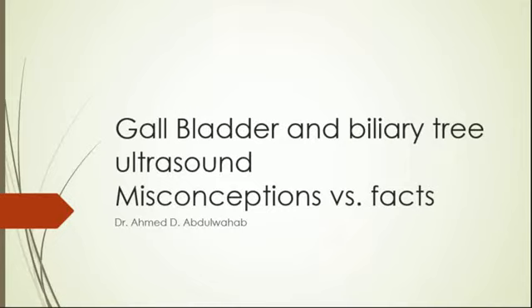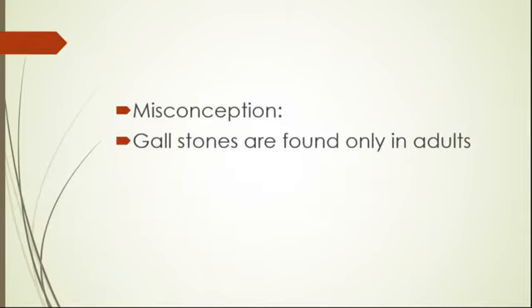Something that we do every day. It's about the gallbladder ultrasound. Every one of us does several gallbladder ultrasounds on a daily basis. The idea behind that is that there are some things that some of us might think are correct information, while in fact they are misconceptions. They are not correct. So just to correct everything in a very rapid and short 20 minutes, I hope. So let's start.